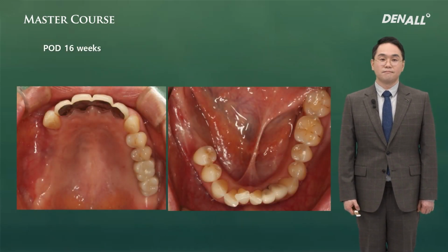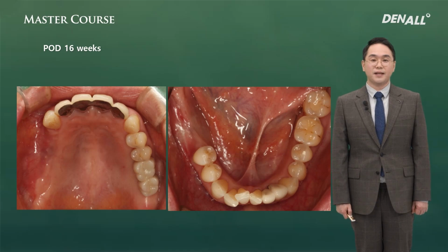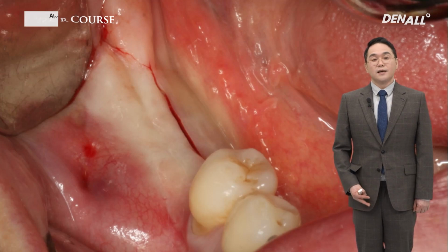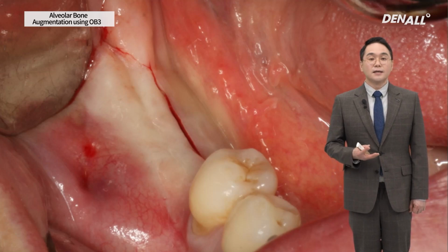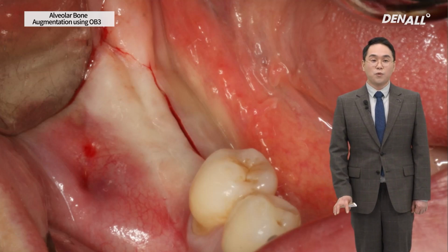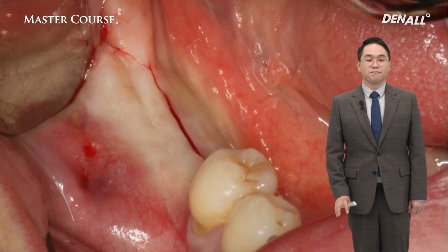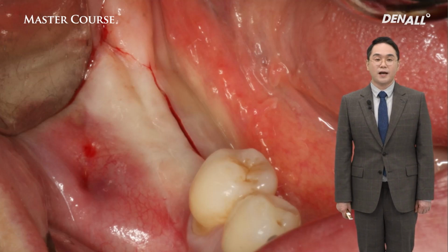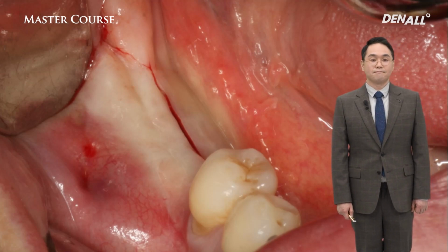is positioned below it. At post-op 4 months healing, the maxillary titanium mesh is not exposed and the Jawbuilder in the mandible is not exposed. After that, in the mandible, Jawbuilder will be removed first because in the maxilla, sinus bone graft was done using lateral approach and the bone quality was not good, so we decided to wait for about 5 months. For the mandible, 4 months would be enough for bone regeneration because the defect size in the mandible was smaller.